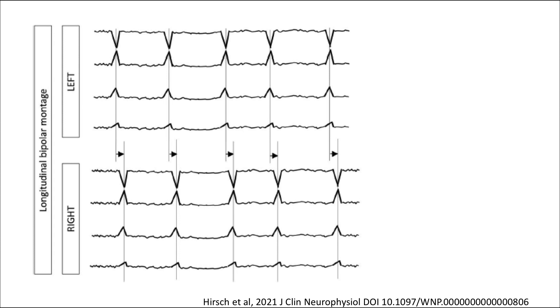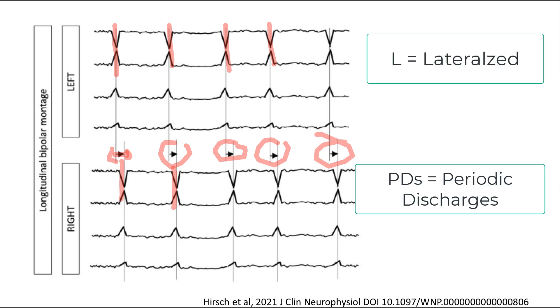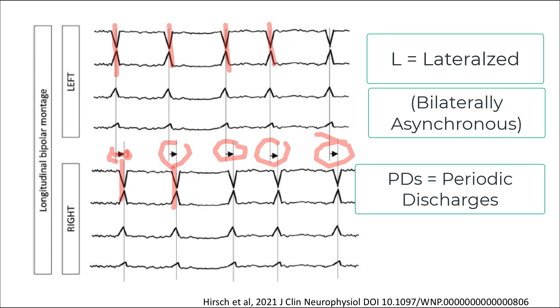This is also an example of lateralized periodic discharges, though trickier to conceptualize. There is a consistent lead-in in the left hemisphere followed by a discharge in the right hemisphere after a specific, always identical interval. Because this timing relationship is constant, we assume the discharges are related and call them lateralized periodic discharges. Because they are present bilaterally with a timing difference, we add the qualifier bilaterally asynchronous rather than asymmetric, giving us bilaterally asynchronous lateralized periodic discharges.